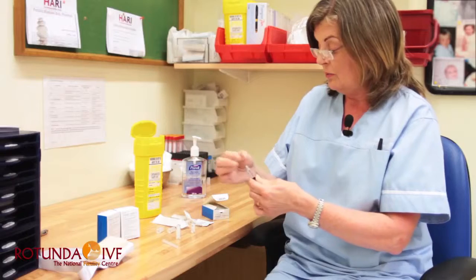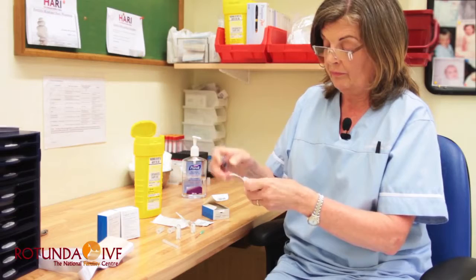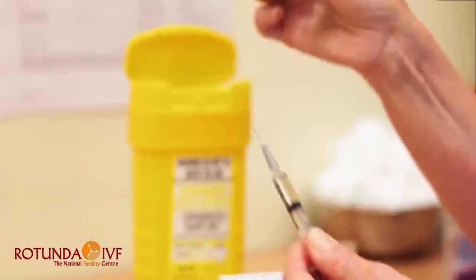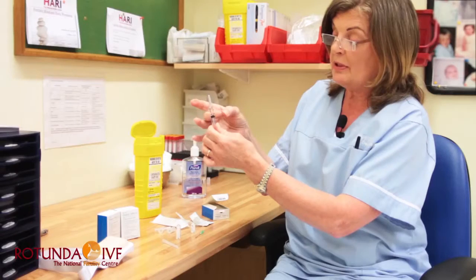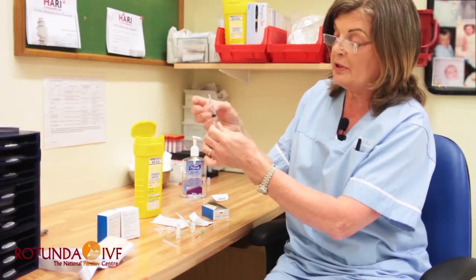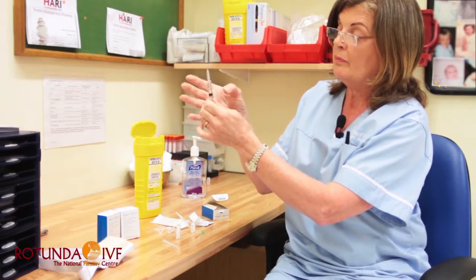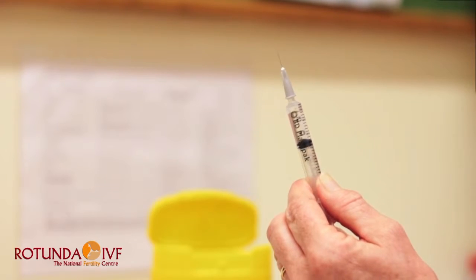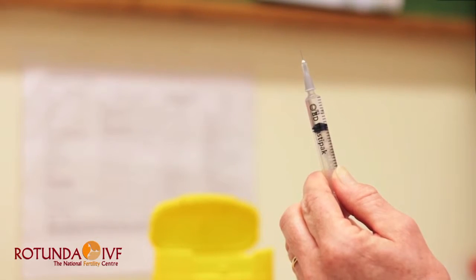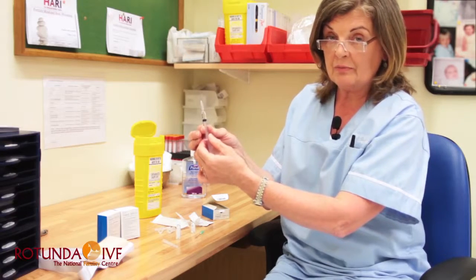Replace the long needle with the small needle. Just push it on firmly. Take off the sheath of the needle. If there are any air bubbles now, just tap them to the top of the syringe. And you can manipulate the plunger back and forward until you expel all the air and you have 1 little drop of fluid at the top of the needle. You're now ready to administer the injection.